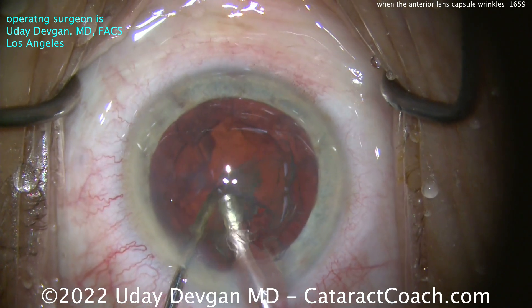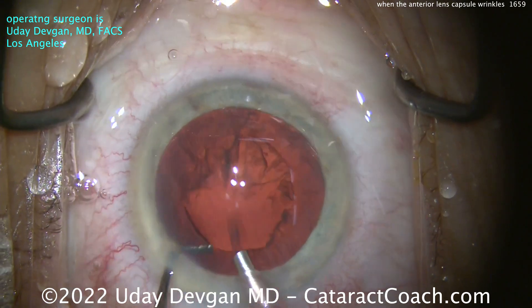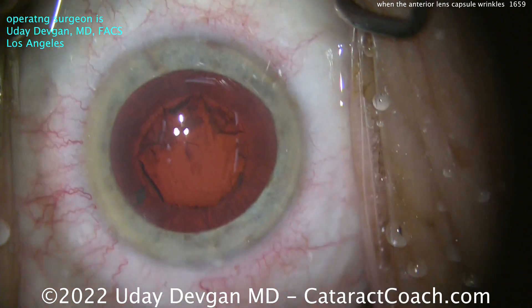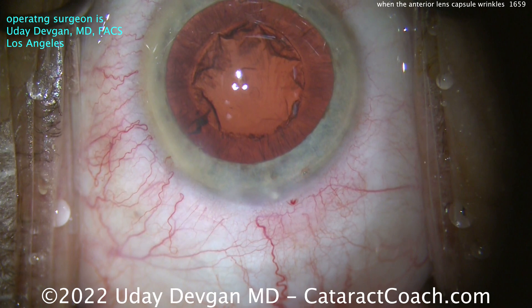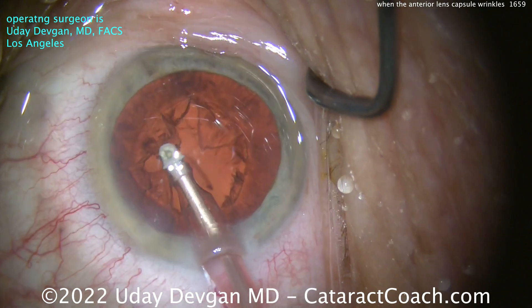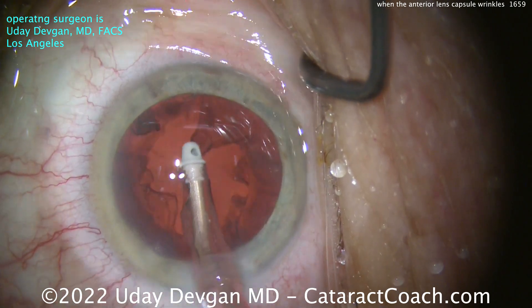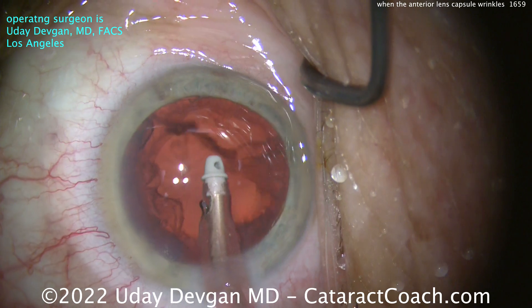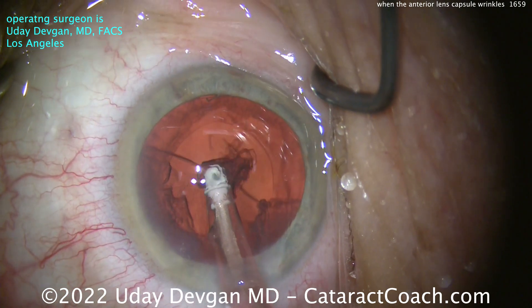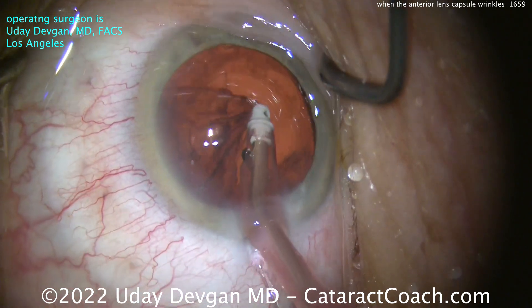I'm looking and I'm seeing a good rhexis. Remember, if you had a quadrant of bad zonular support, that rhexis would go from round to shaped like the letter D — the flat part of the D being where the zonular loss is. But I don't see that. Cortex removal is very important. As we do this, I'm watching the rhexis edge, making sure it stays round, and also looking at the capsule bag equator. I'm going a little slower than I normally would for cortex removal, just to be extra cautious.